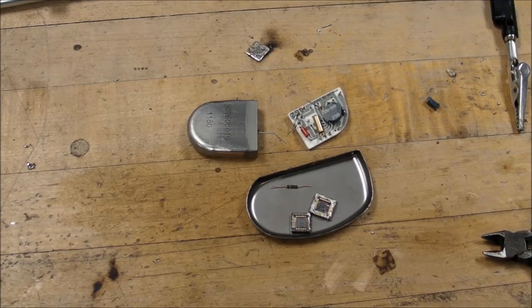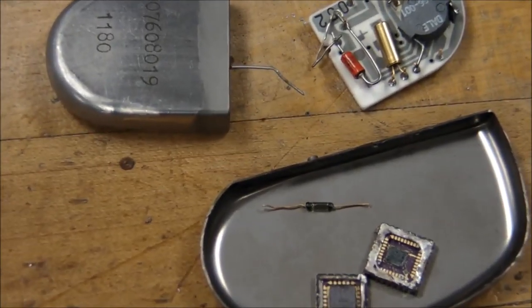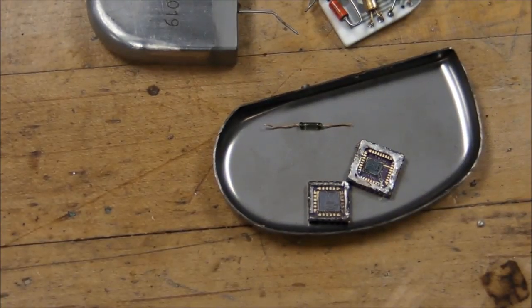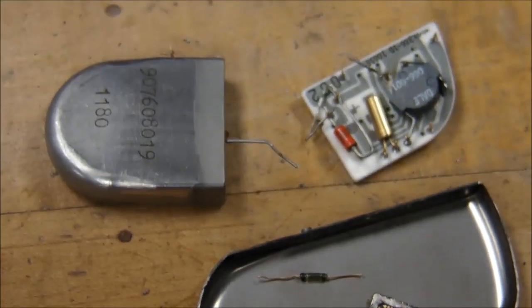Well, there you go. That's a look at what's inside a 29-year-old pacemaker. I really don't know what I'm going to do with these things, except maybe that reed switch. I'll definitely keep that reed switch. That's probably the smallest reed switch I've ever seen. But everything else is just junk.